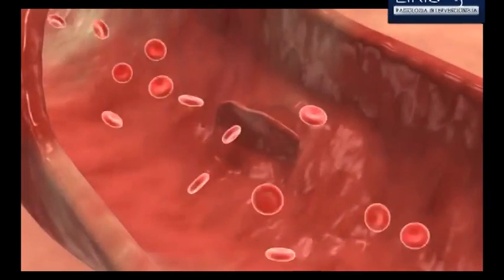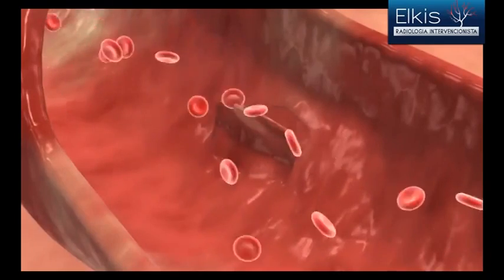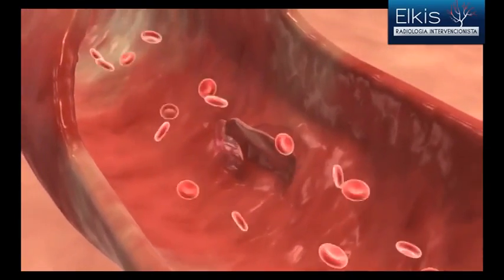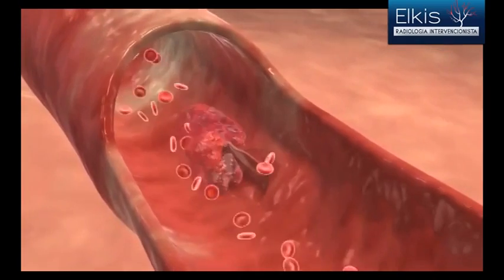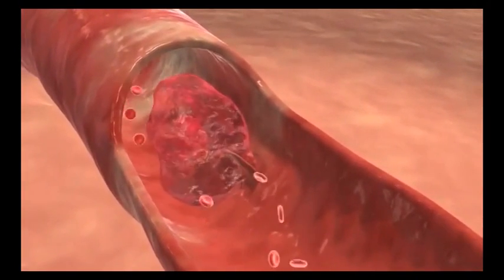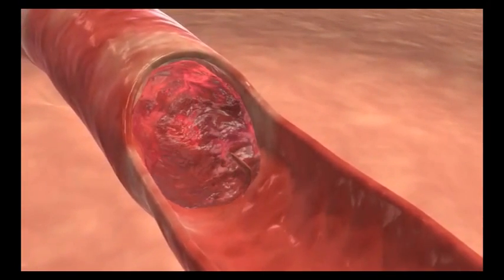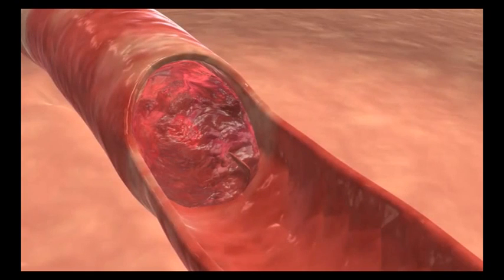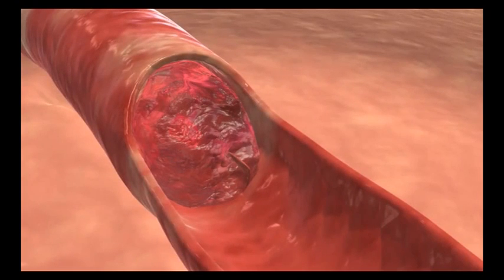Fast occlusive thrombus, vasoconstricted vessel. Acute coronary syndrome is very different from stable atherosclerotic disease. No wonder that conventional balloon expandable stents show a higher frequency of adverse events in the early phase of ACS treatment.